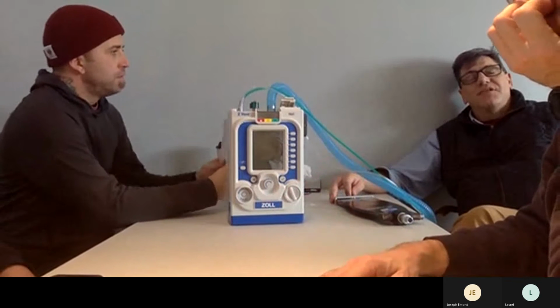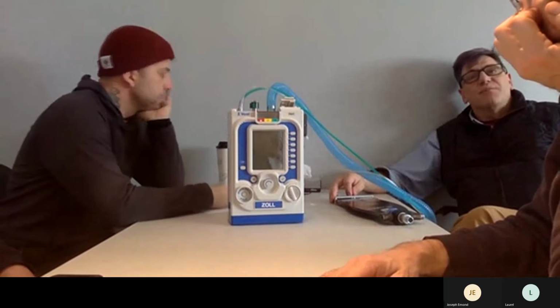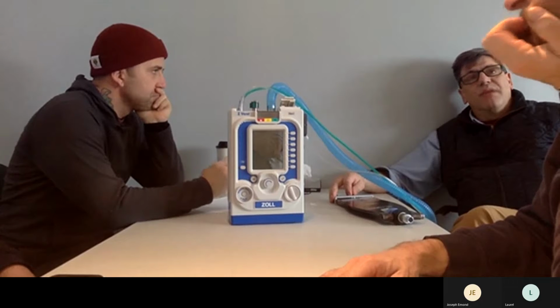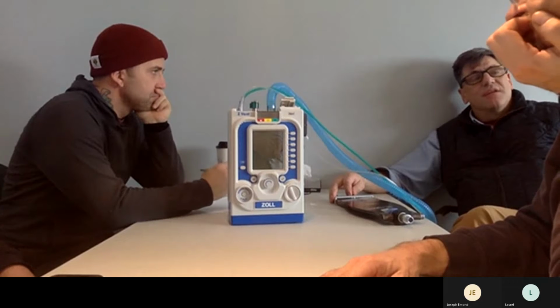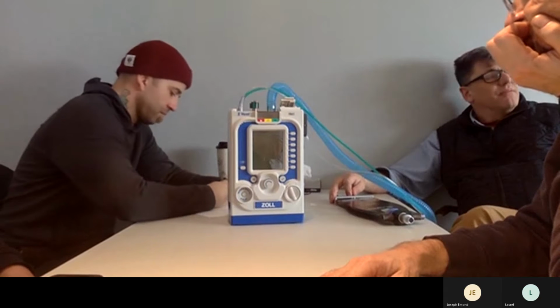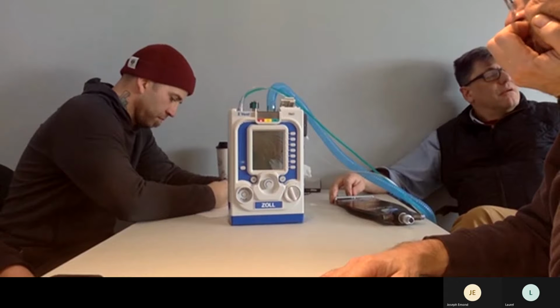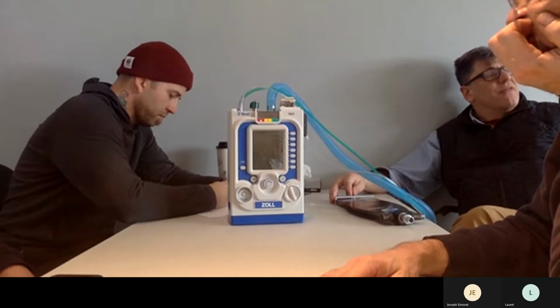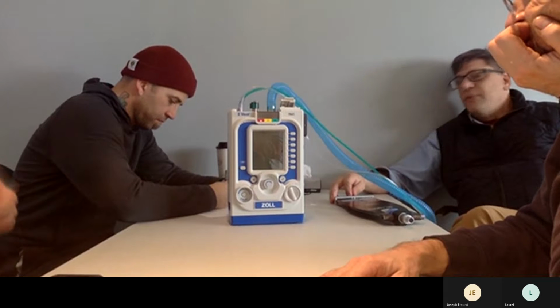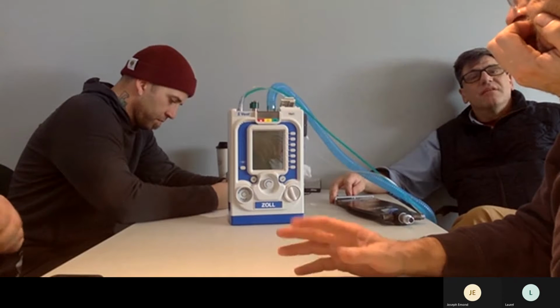If I have CPAP at 5 plus pressure support of 10 more, the keyword being additive: CPAP plus pressure support. You heard me say that a few times? So if I have 5 of CPAP plus pressure support of 5 more, my peak inspiratory pressure will be 10.